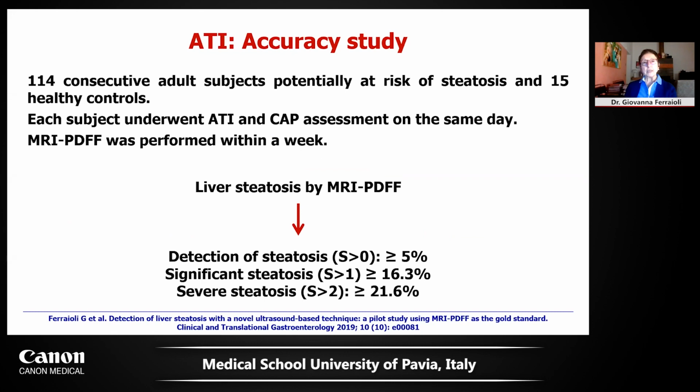The accuracy of ATI was assessed by our group in consecutive subjects potentially at risk of steatosis and also healthy volunteers. And each subject underwent, on the same day, measurements with the ATI and CAP, and the PDFF was performed within a week.